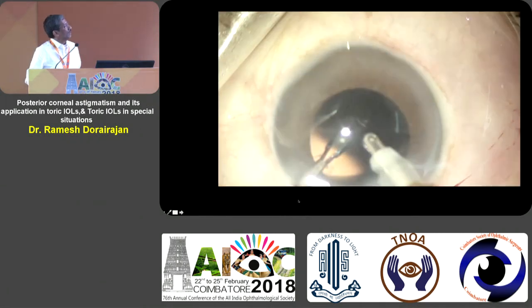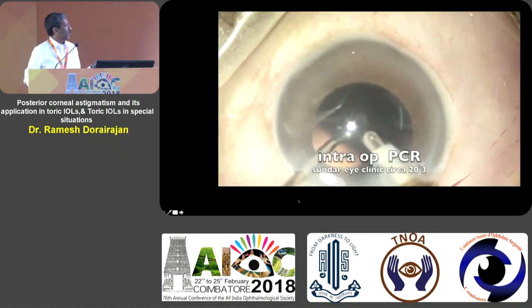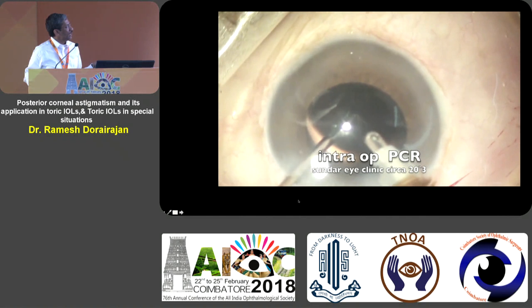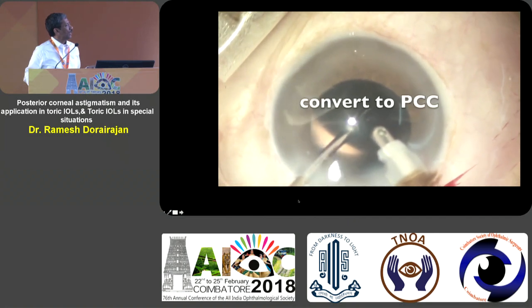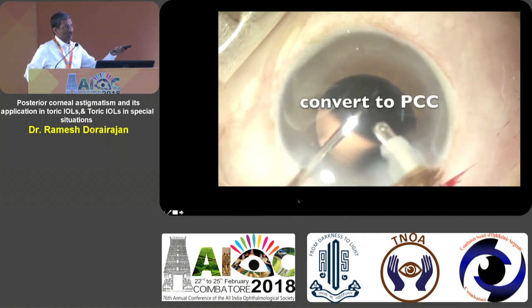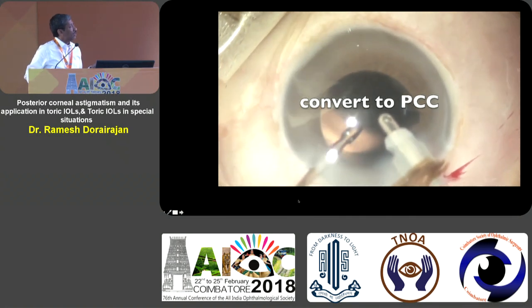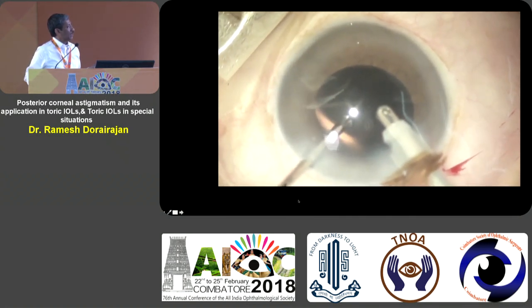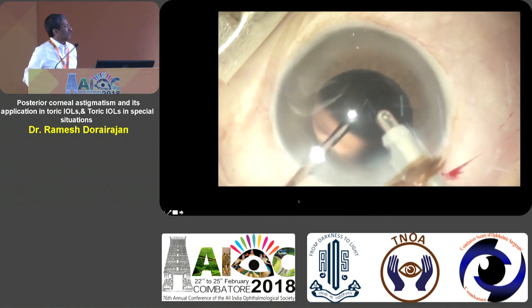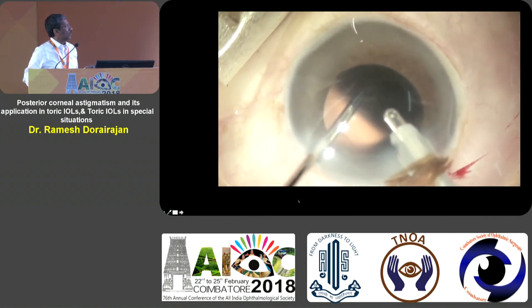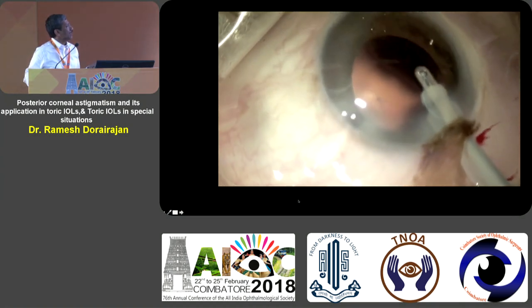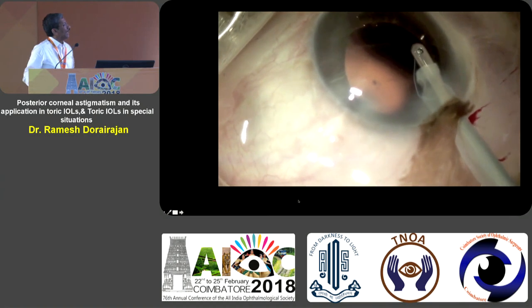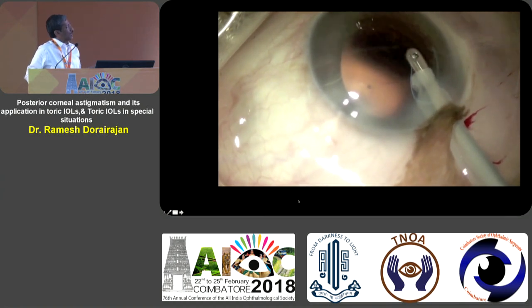This is another patient from around 2013. During surgery I developed a small posterior capsule rupture — you can see the tag floating. I did not come out with the irrigation-aspiration probe. I went in through the side port with a one-millimeter micro-forceps, tore the flap into a small circle to create a controlled posterior CCC, and then decided to go ahead and place a toric lens in this patient, which went off successfully.